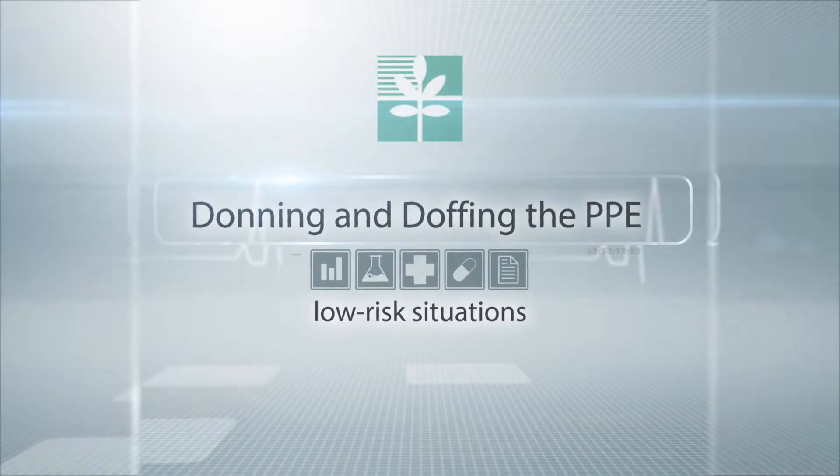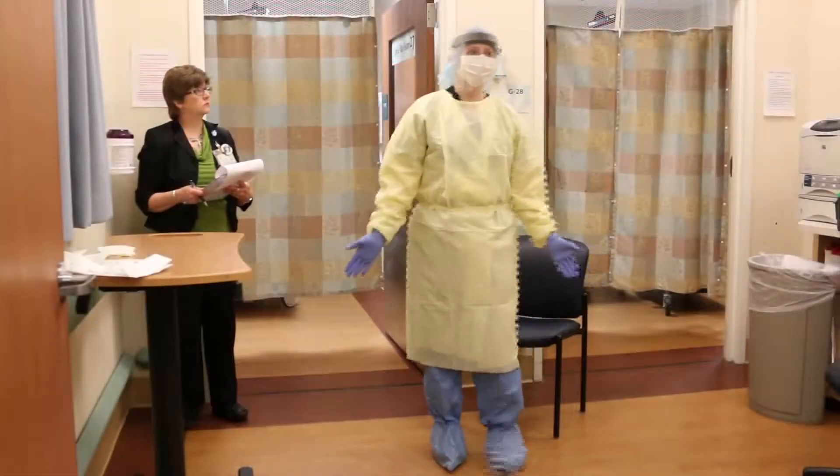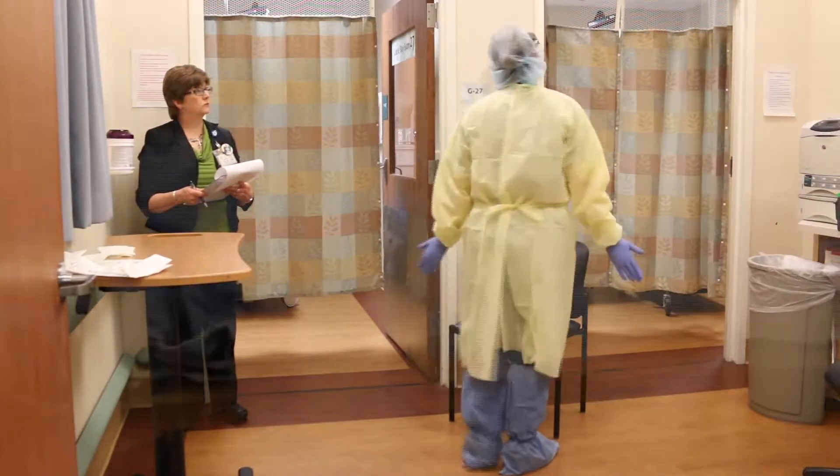Let's review donning and doffing the PPE for low-risk situations. First, you need the appropriate personal protective equipment.